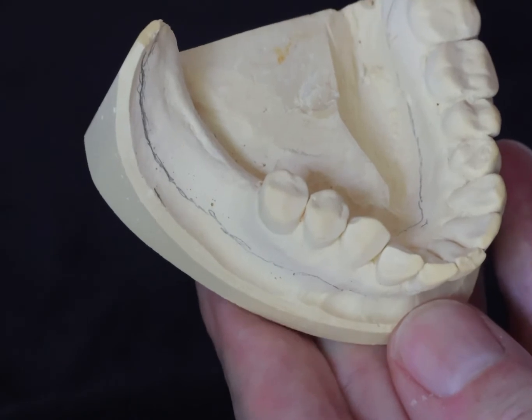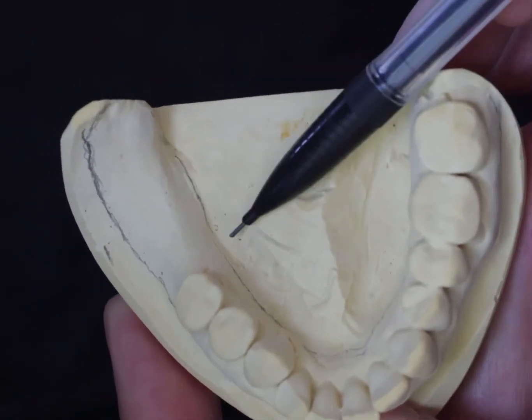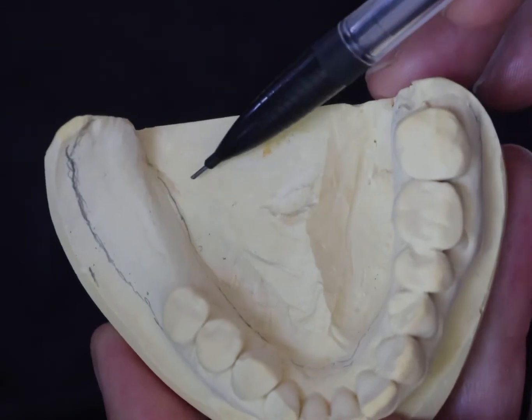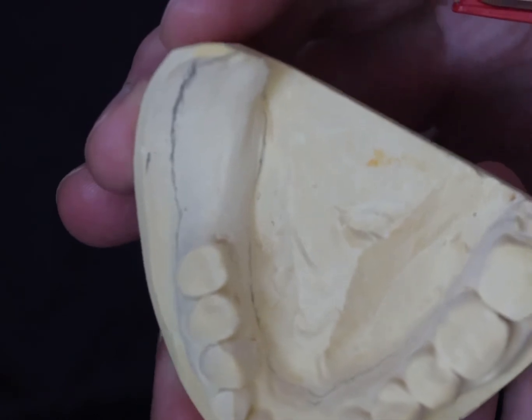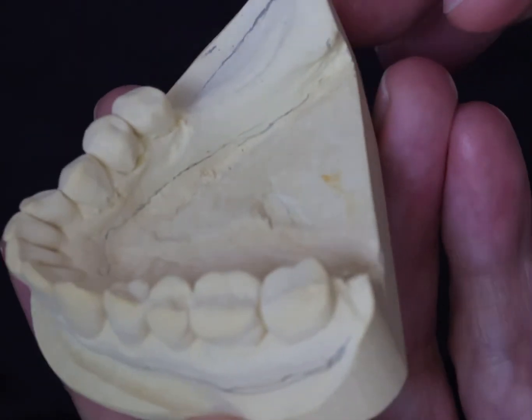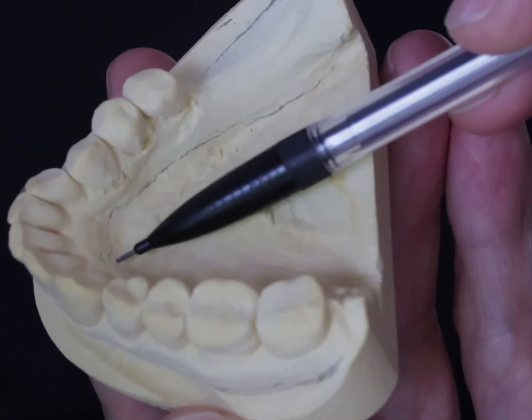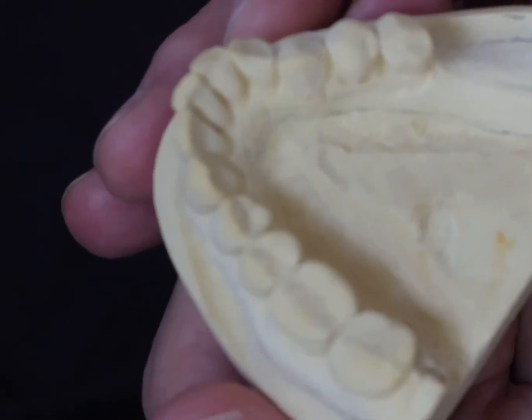Cover the retromolar pad and mylohyoid line. The sulcal depth there should have been defined by your primary impression — if your primary is under-extended, you're going to struggle at this point. The other critical area is the lingual frenum. We have a bifurcated frenum here, and it's getting slightly closer.